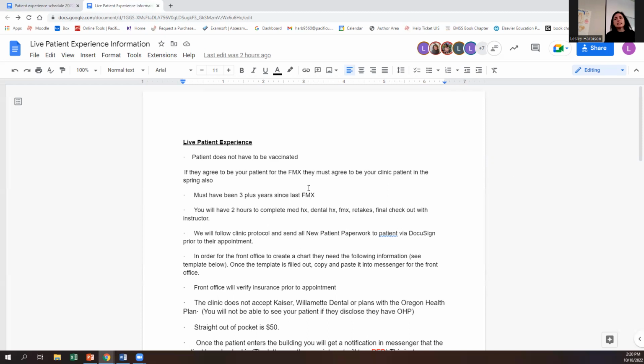So try and stick to this 3 year mark. If we're treating them like real patients, we're not going to take an FMX sooner than 3 years. I know everyone always says it's in my family and they want to help me, but try and do that the best you can.